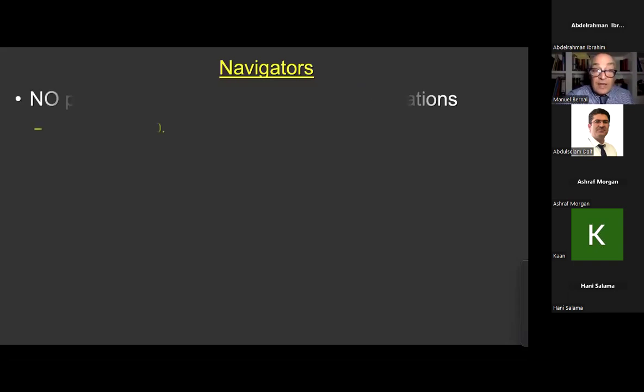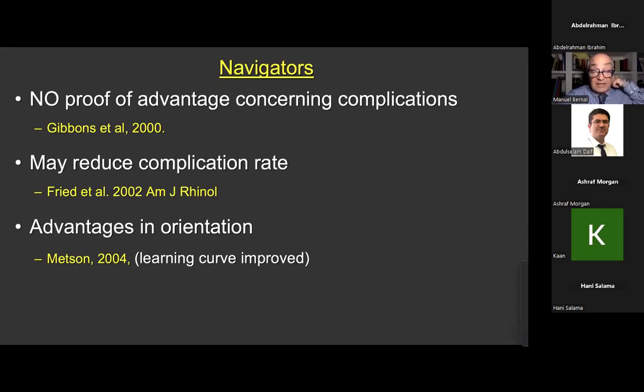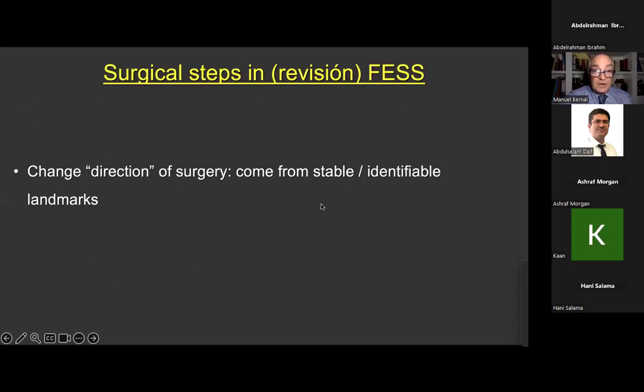And also, these are quite old literature studies on that, it may give you, as I mentioned, advantages in the orientation, but it does not reduce your stress during surgery. We tested this with a very nice study that was published a couple of years ago.